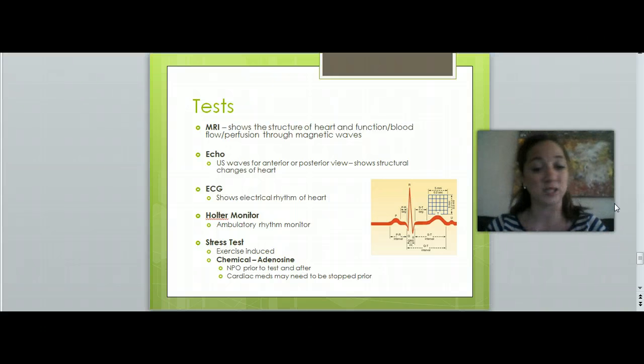But just be looking out for that because it's interesting. A Holter monitor is basically an electrocardiogram, but you can take it anywhere. So if we really want to monitor what a patient's heart is doing throughout the day, just a normal day of their life, we'll put them on a Holter monitor. They wear it in a little sack on their hip, and then we hook them up to the electrodes, and then they download every night the rhythms from the day.